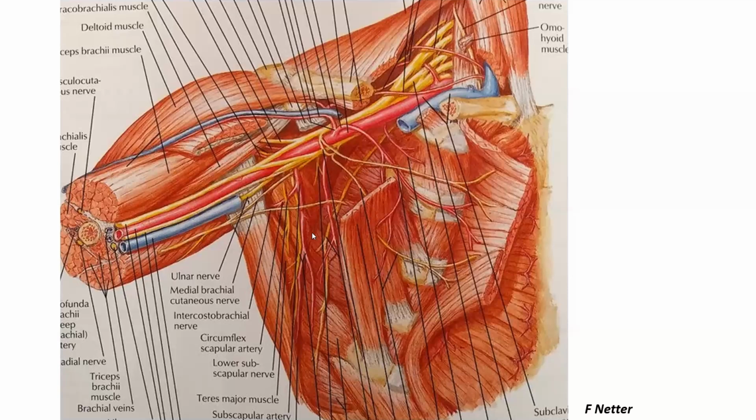The third important anatomical idea of the axillary artery is its relationship with the brachial plexus. The proximal to mid axillary arteries do not overlap with the brachial plexus. The distal axillary artery, the so-called A3, while it's favorable in terms of its relationship with the axillary vein, is not favorable in terms of its overlap with the cords of the brachial plexus.